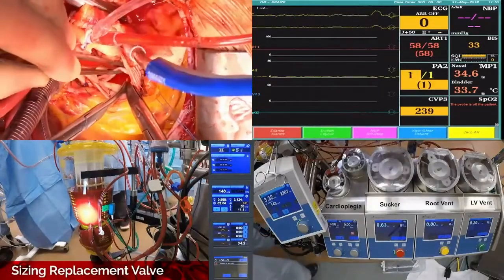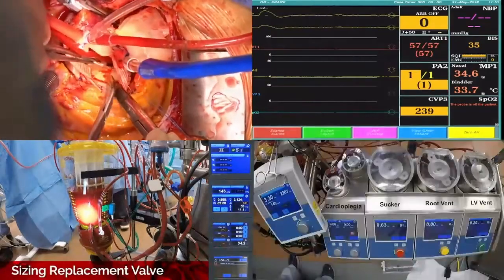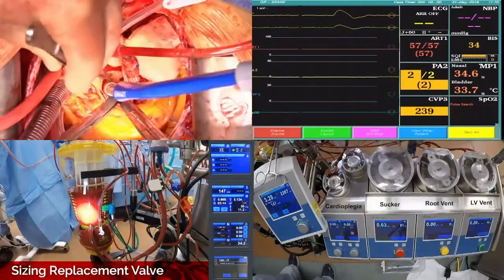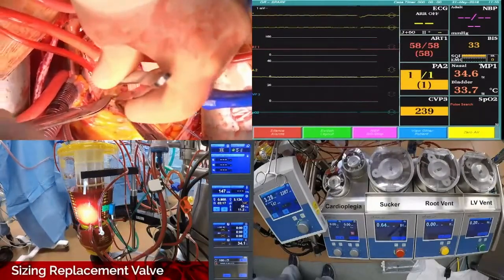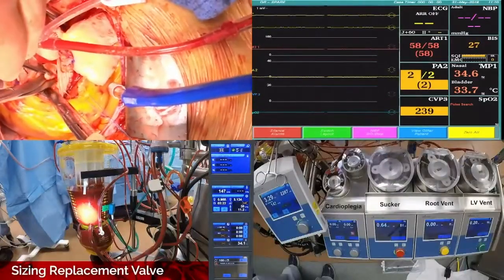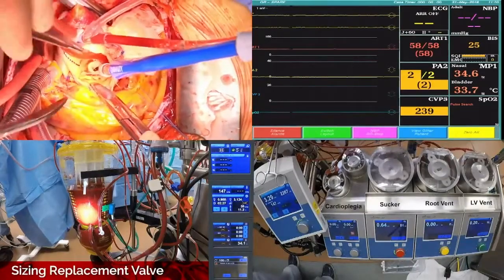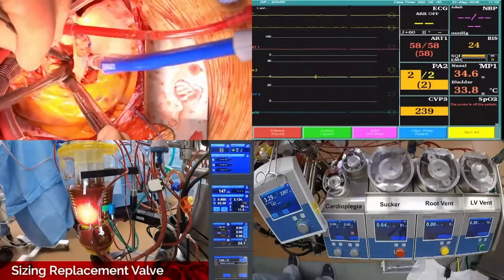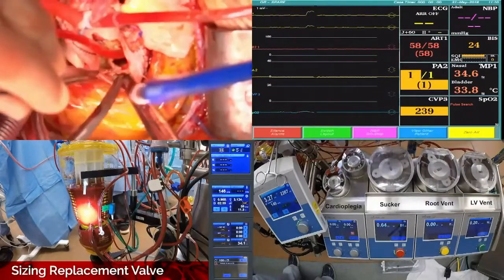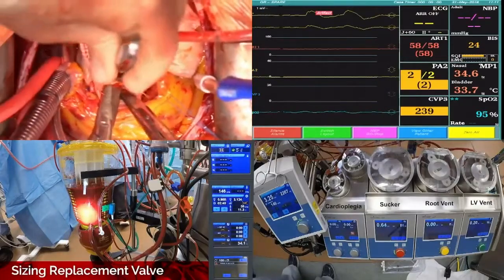So you're cutting the valve out here, cutting leaflets out. Yeah, it's super easy here. If you look at about 5 o'clock, this is a Safi move here. My assistant Denise is retracting the neo-sinotubular junction inside the graft. It's like the perfect curve with the Cooley scissors to expose the annulus, and all you've got to do is slide it around opposite of me, and it makes for a nice exposure without having to use some fancy retractor or something like that. Neat technique that I learned at my time down at Herman Medical Center.